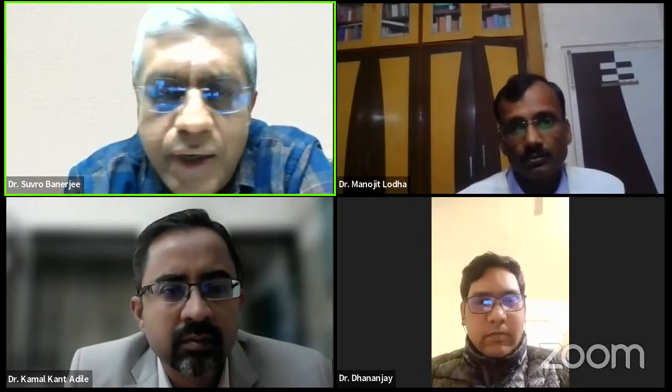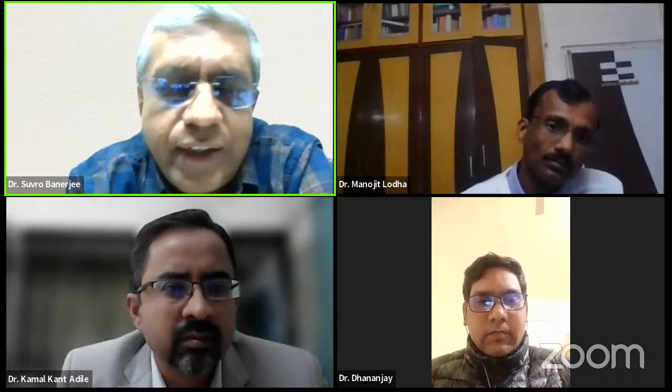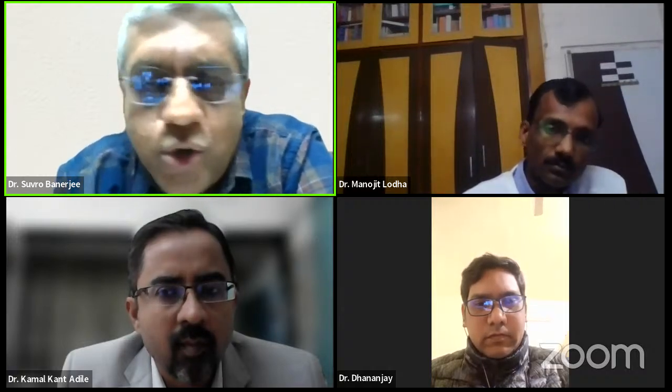So I do it normally. The only exception would be if there is too much thrombus and I really think there was a slow flow to start with. Then I can bring this patient back after maybe 24 or 48 hours and go for a post-dilatation. But usually in most cases I try to do the post-dilatation even in primary.